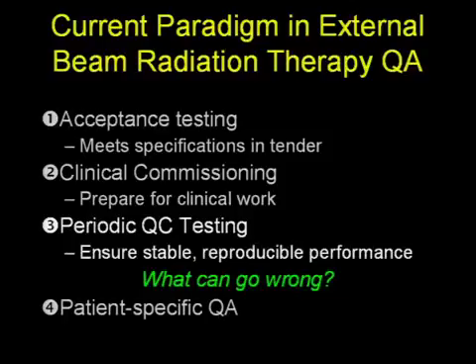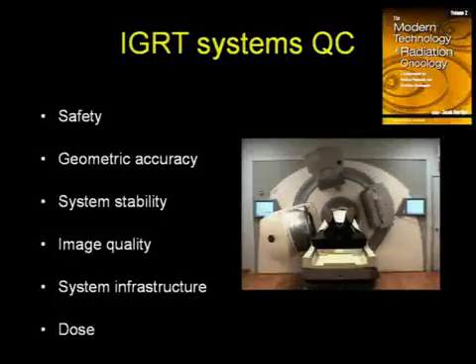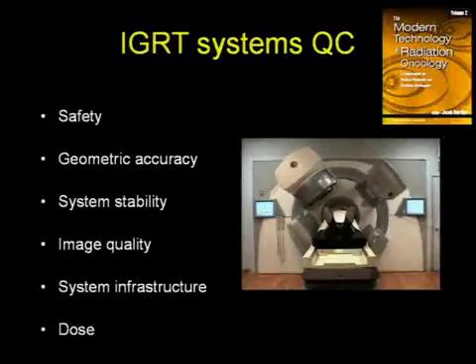So essentially, when initiating a quality control program on new technology, the person who designs this program should keep asking themselves, what is it that can go wrong, and how can I ensure that this parameter or this process does not? So there is some guidance available out in the literature.